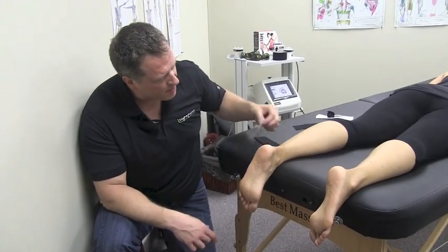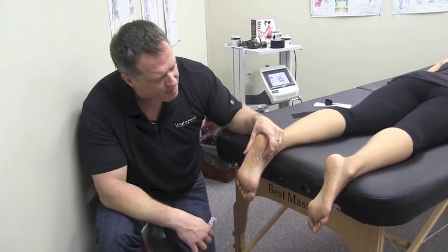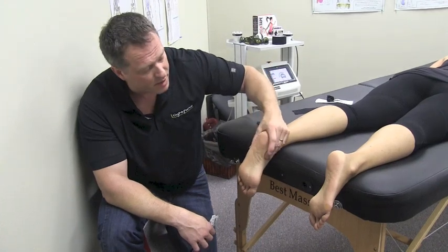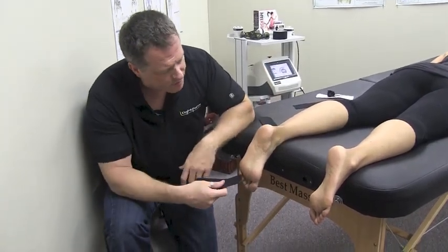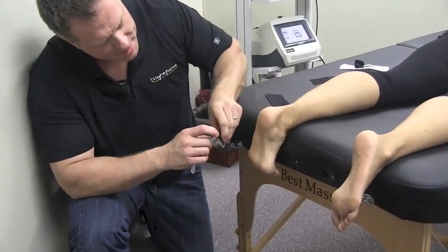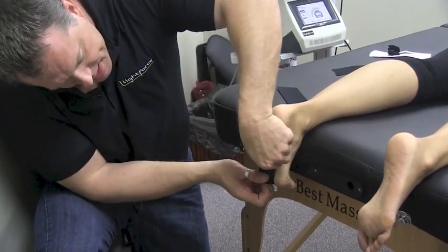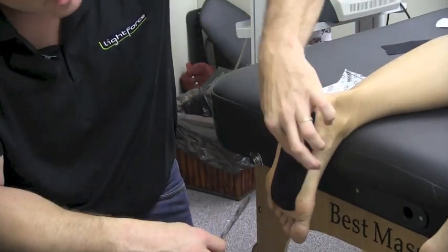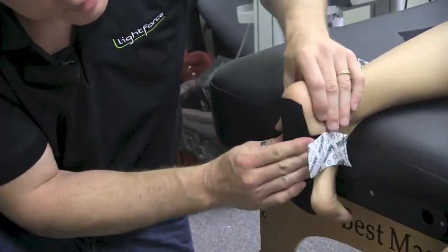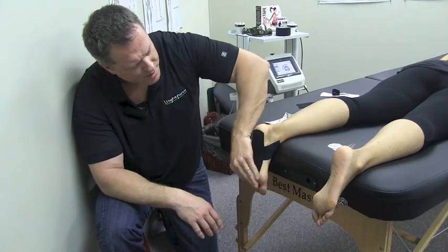The second taping method after laser treatment is for basic support and a lifting effect on the bottom of the foot, also to decompress and change the inversion or eversion slightly to help with heel strike — using the solid strips. Pre-cut the tape, stretch the tissue as before, and extend the toes up. It's easier to start at the bottom of the toes so you know your end point. Apply the decompression strip in the middle — stretch a hundred percent, back off half, come right across the center. That gives extra lift to the fascia and extra support for the plantar fascia after laser treatment.